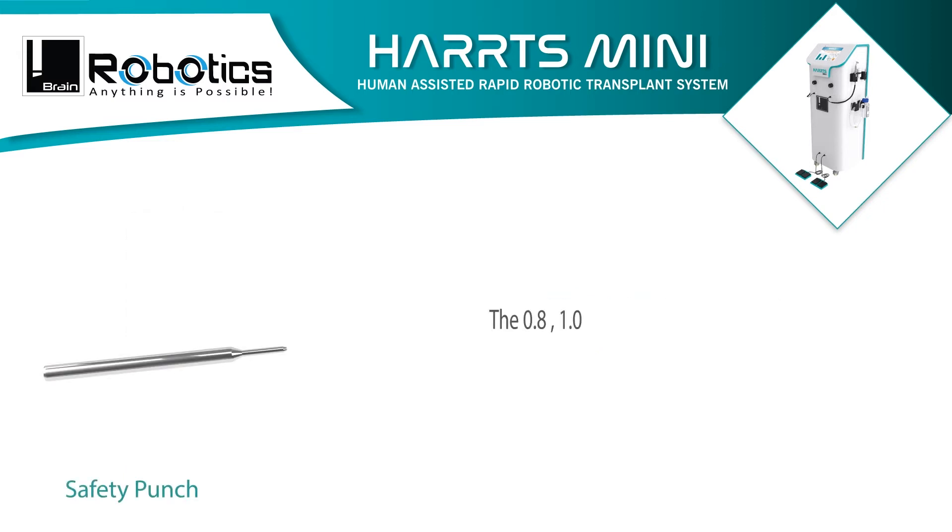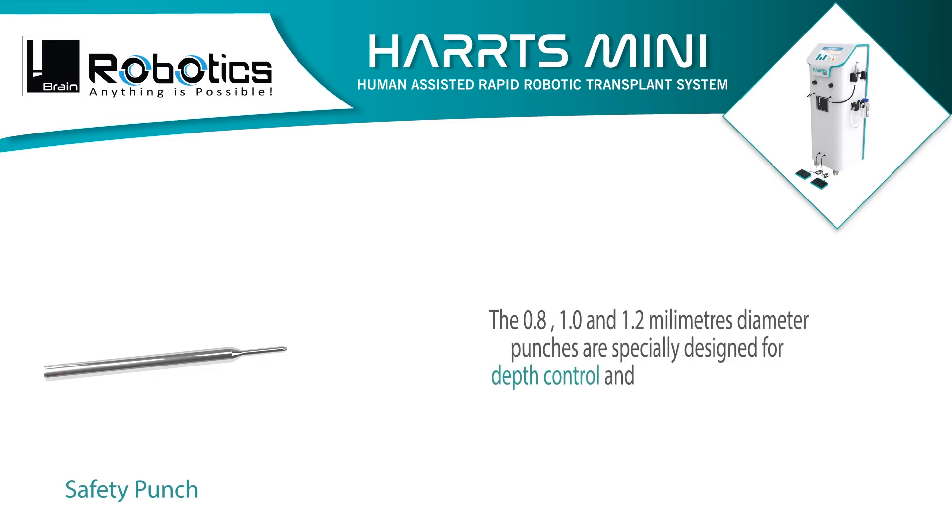The 0.8, 1.0, and 1.2 mm diameter punches are specially designed for depth control, and the silicone covering over the step avoids rotational skin abrasion.